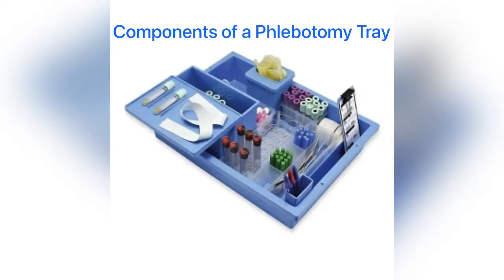Components of a phlebotomy tray are syringe, multi-sample blood collection needles, tourniquet, safety transfer device, blood culture bottle, microcontainer tube, BD Eclipse, Portex Needle-Pro, and microhematocrit tubes.